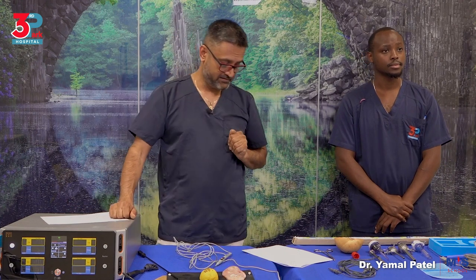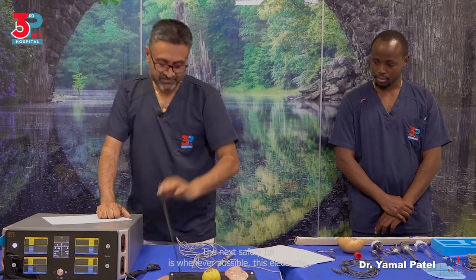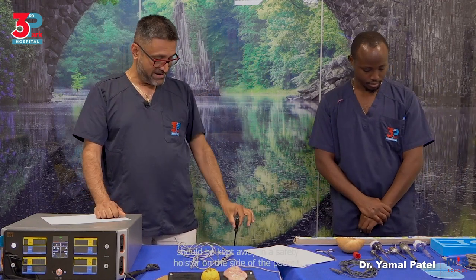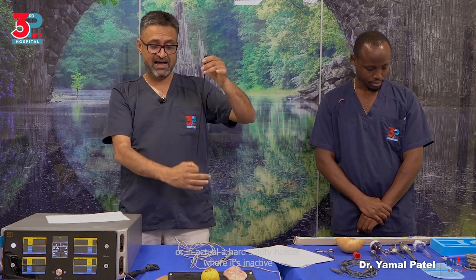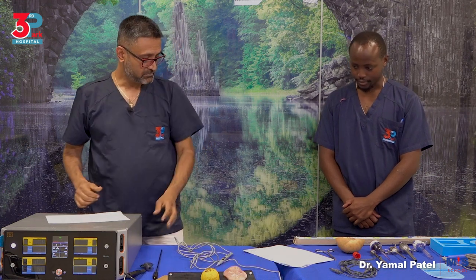The next safety tip is whenever possible, this electrode, when it's not in use, should be kept away in a safety holster on the side of the patient. So it could be in the pouch or in a hard safety holster, where if activated by mistake, it is inside a safety holster.